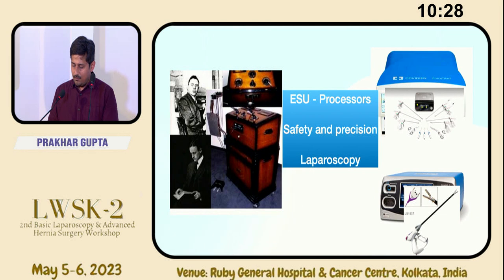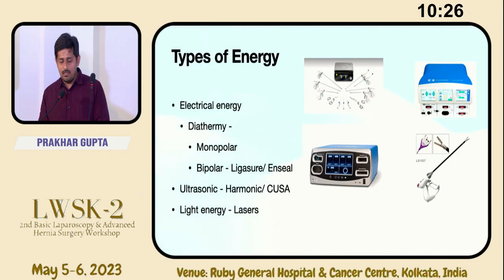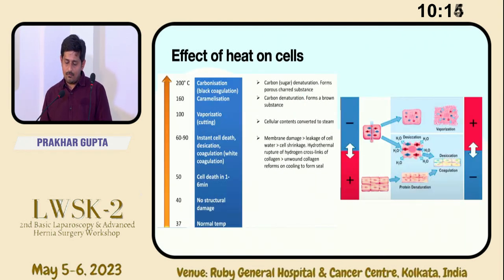At the same time, it has enabled us to do even the most complex cases laparoscopically. The types of energy available to us are electrical energy in the form of monopolar and bipolar, mechanical energy in the form of harmonic, and light energy in the form of lasers. Before moving on to the energy sources themselves, we'll first look at what effect heat has on cells. 37 degrees Celsius is the normal temperature. At 60 to 90 degrees Celsius, coagulation and desiccation occur. At 100 degrees Celsius, the cells are converted into steam and they burst. At 200 degrees Celsius, charring occurs.